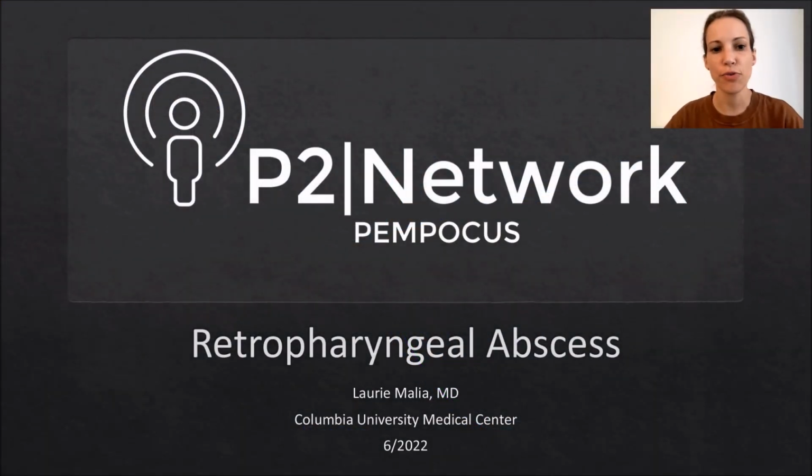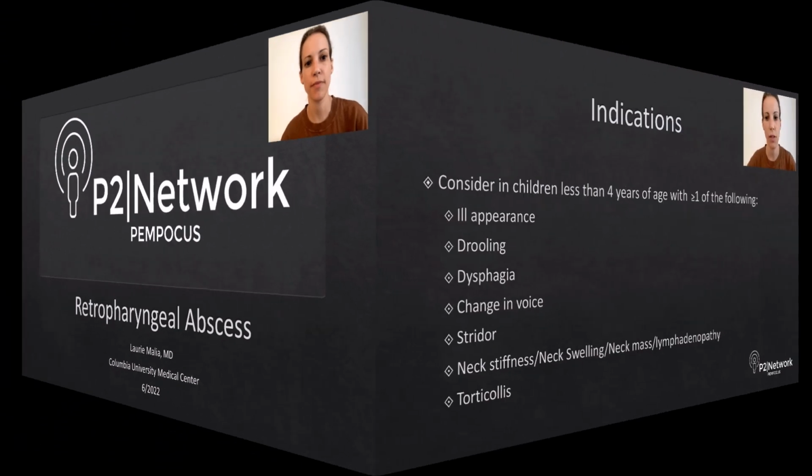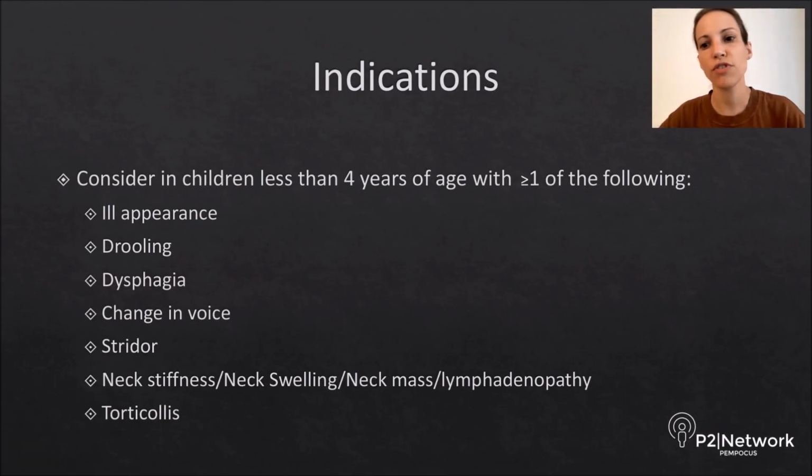Today we're going to review the use of POCUS in the evaluation of a retropharyngeal abscess. So first let's review some indications that may prompt you to evaluate for an RPA.